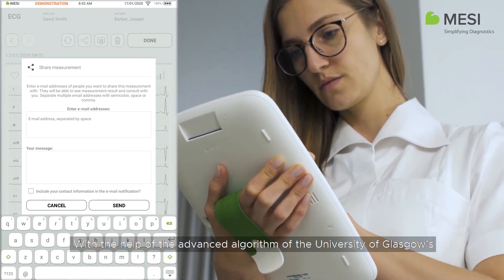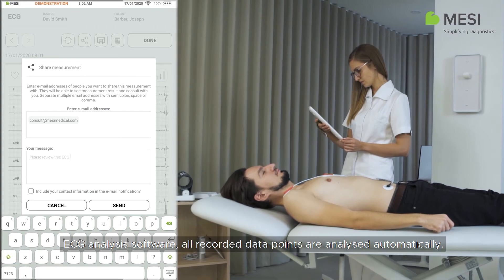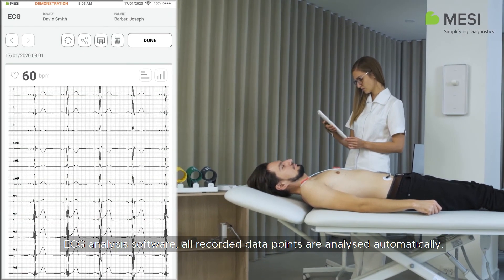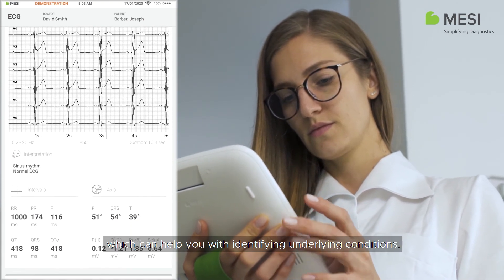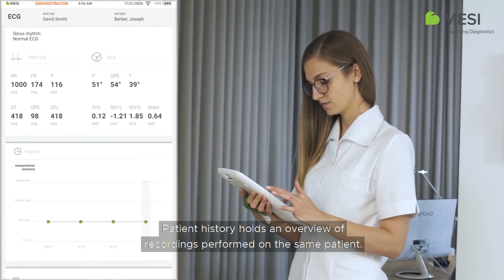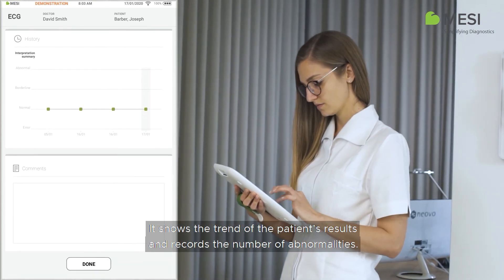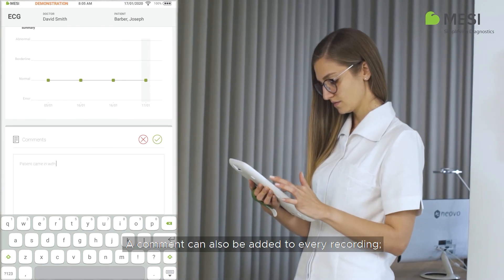With the help of the advanced algorithm of the University of Glasgow's ECG analysis software, all recorded data points are analyzed automatically. It provides a diagnosis which can help you with identifying underlying conditions. Patient history holds an overview of recordings performed on the same patient. It shows the trend of the patient's results and records the number of abnormalities. A comment can also be added to every recording.